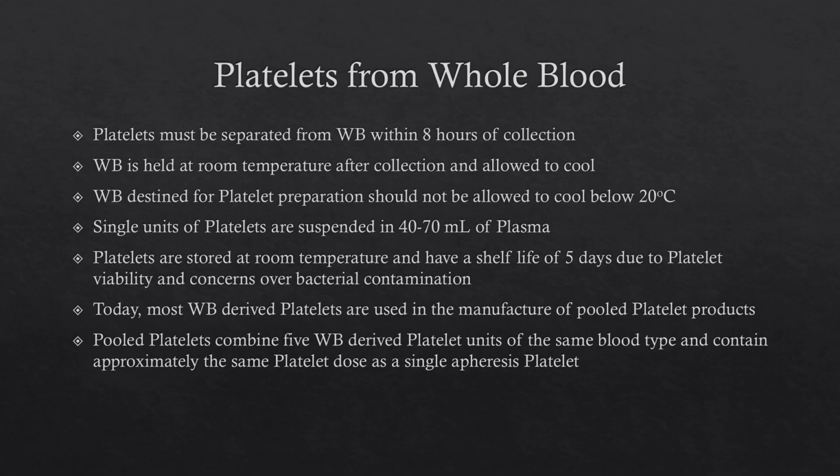Platelet components. So let's first talk about the platelets that we derive from a whole blood collection. This is not as common as an apheresis platelet, but in the modern blood bank, there's still a place for whole blood derived platelets. One of the most important factors in making a platelet component from whole blood is that the platelets must be separated from the whole blood within 8 hours of the collection.